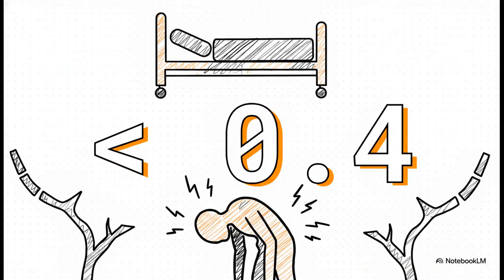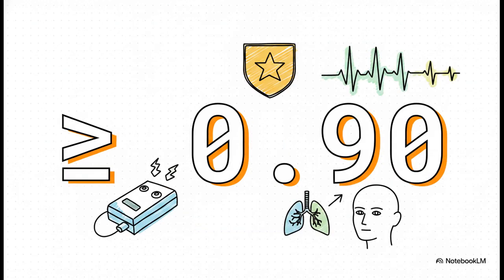If that ratio spits out less than 0.4, the patient is in a highly, highly dangerous state. Below 0.4, the patient feels incredibly weak, they're probably terrified, and they literally cannot even lift their own head off the bed. This is the number we're waiting for: a train of 4 ratio of greater than or equal to 0.90. This is it, the life-saving gold standard threshold. When you see 90% recovery of that 4th twitch compared to the first, you know definitively that pharyngeal tone and vital airway reflexes are fully back online. That is when it is absolutely safe to extubate.